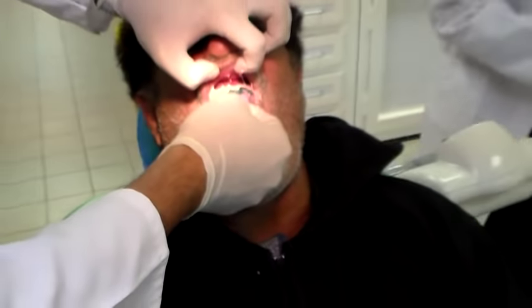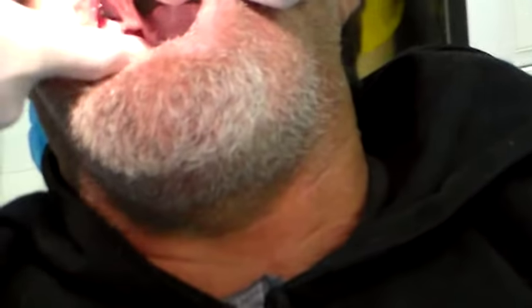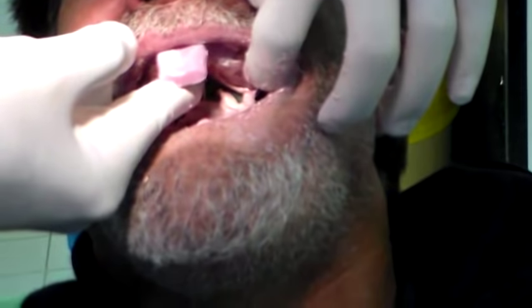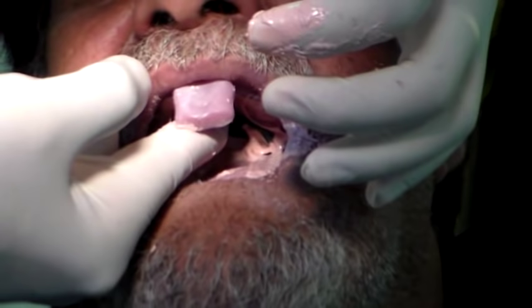I am going to place it into the patient's mouth. Lift up the frenum, make sure I got the frenum position right. Place it in the patient's mouth. I have some material falling off — I want to scoop it back onto the tray. Wait for a few seconds because the material will be flowing.